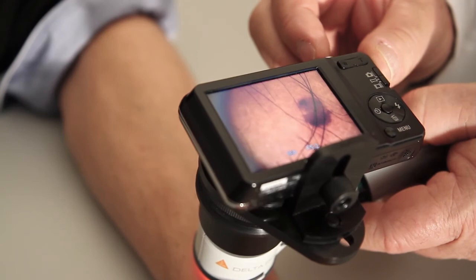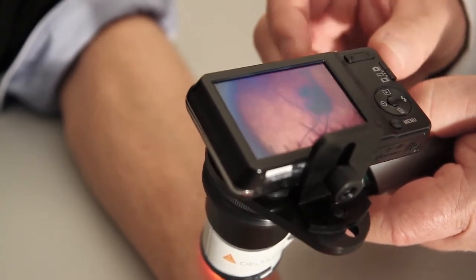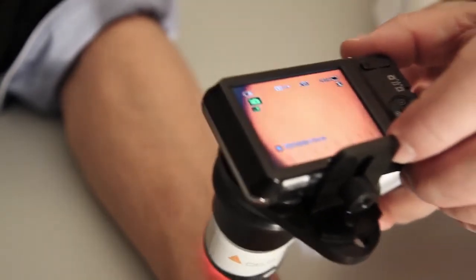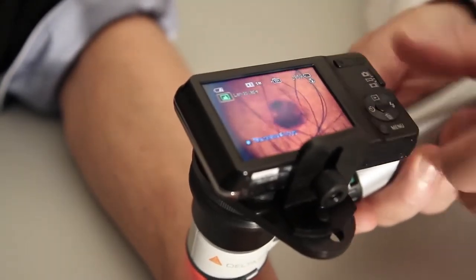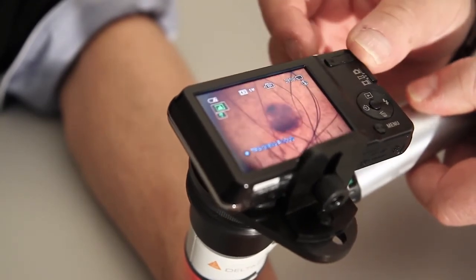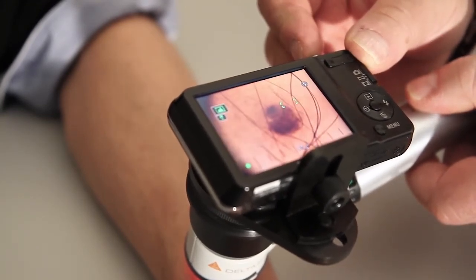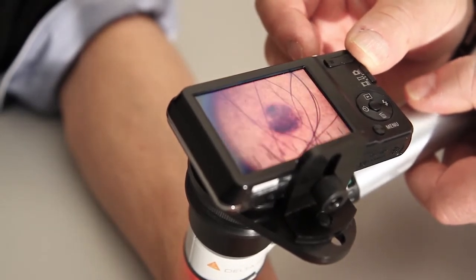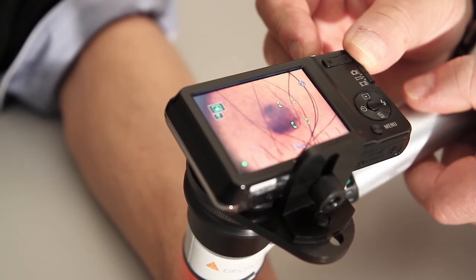Often I take a photograph at that point just to have one already. It's a bit fiddly, isn't it? And then just make sure you're nice and centered here. And then if you partially depress the image capture button, it automatically focuses, and then a deep depress takes the image. The image is now on the camera and ready to be used.